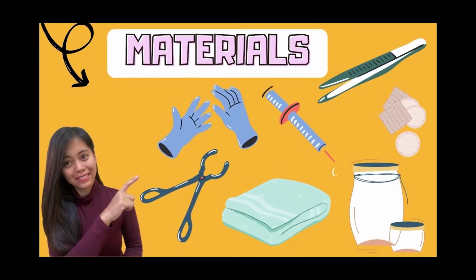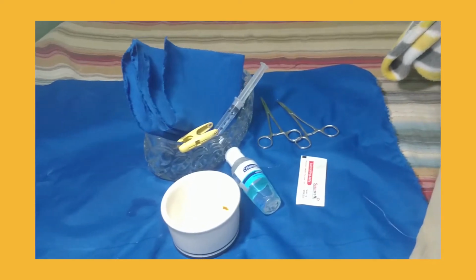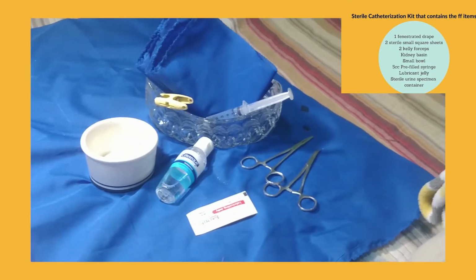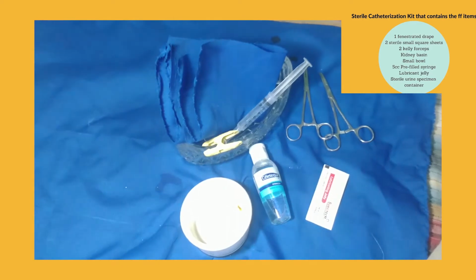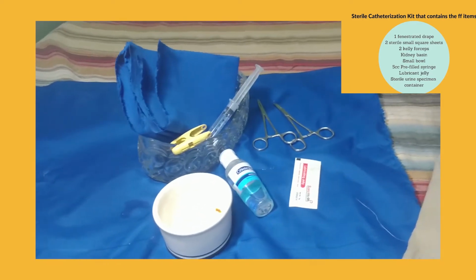The materials that we need in this procedure are as follows: Sterile Catheterization Kit or Drapes containing the following items: 1 fenestrated drape, 2 sterile small square sheets, 2 Kelly forceps, kidney basin, small bowl, pre-filled 5cc disposable syringe, and lubricating jelly.